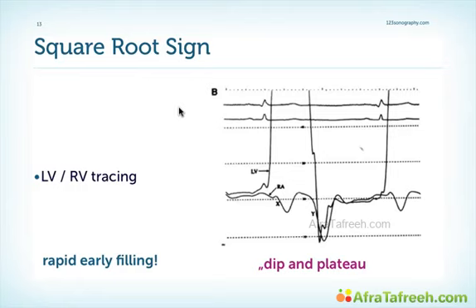But let's come back to the way the ventricle fills during diastole in the setting of constriction. This is a pressure tracing of the left ventricle. And remember, during early diastole, we have unimpaired or free filling of the left ventricle. So we have rather rapid filling and rapid pressure rise in the left ventricle. Then, however, we have a resistance to filling caused by the tight pericardium, and we don't have any further pressure rise. We have pressure equilibration.